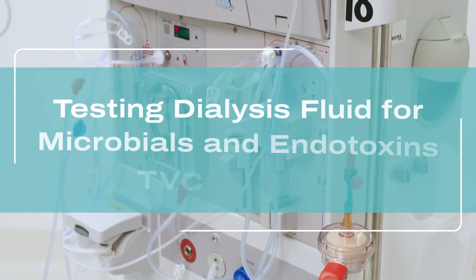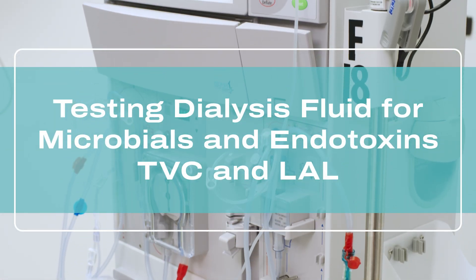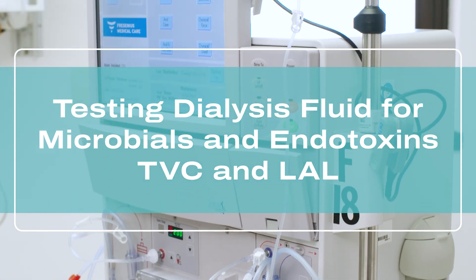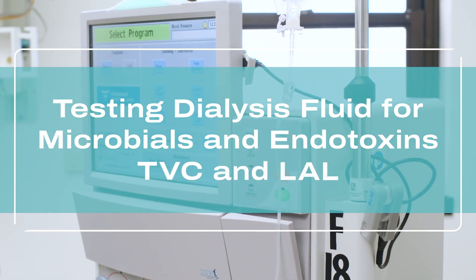In this video, we'll cover proper testing and monitoring procedure of dialysate or dialysis fluid for microbials and endotoxins, otherwise known as total viable microbial count, TVC, and bacterial endotoxin, LAL.